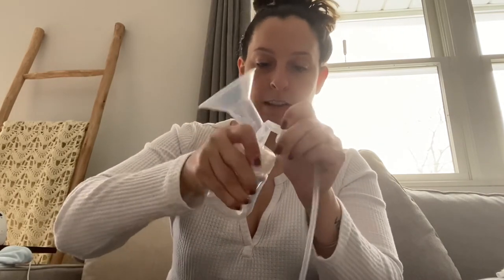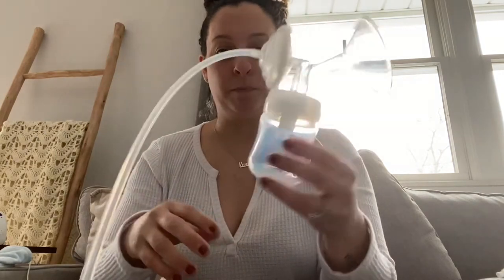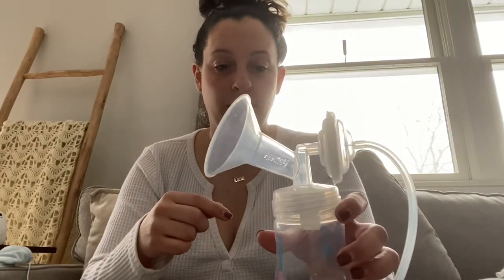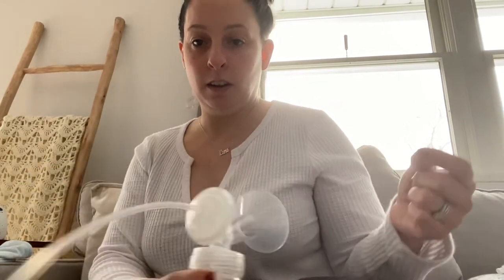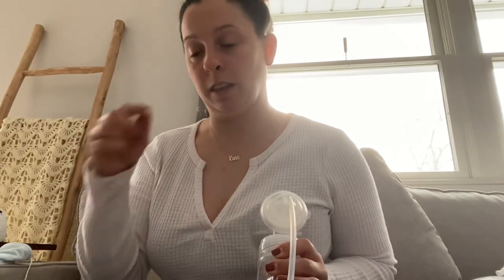For attaching this to you for pumping, you just want to make sure that your nipple is centered in this hole. You'll hold on to it, and if you have one of those hands-free bras that's fine, otherwise you hold it the whole time and control the pump with your other hand when you have to switch from one setting to the other.